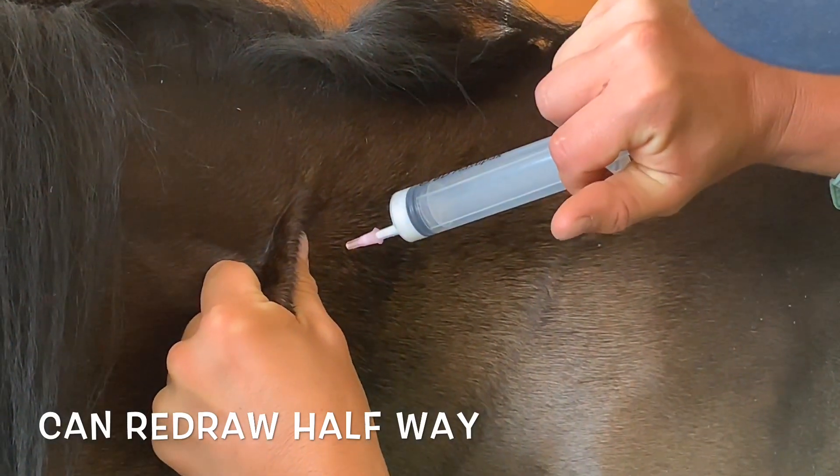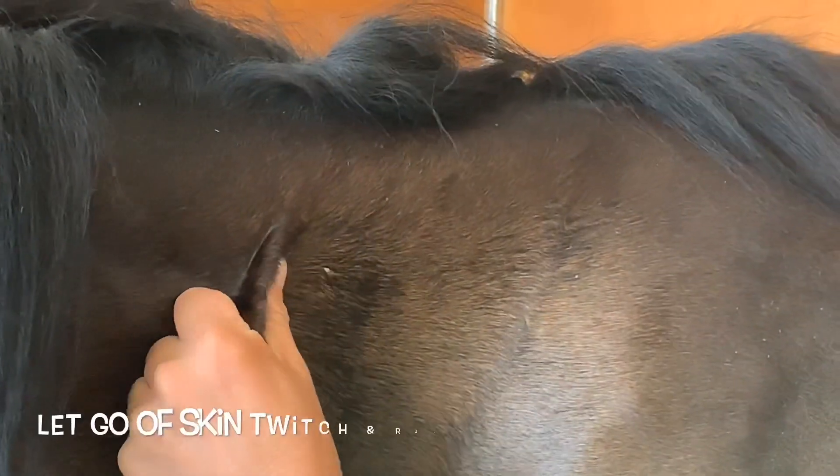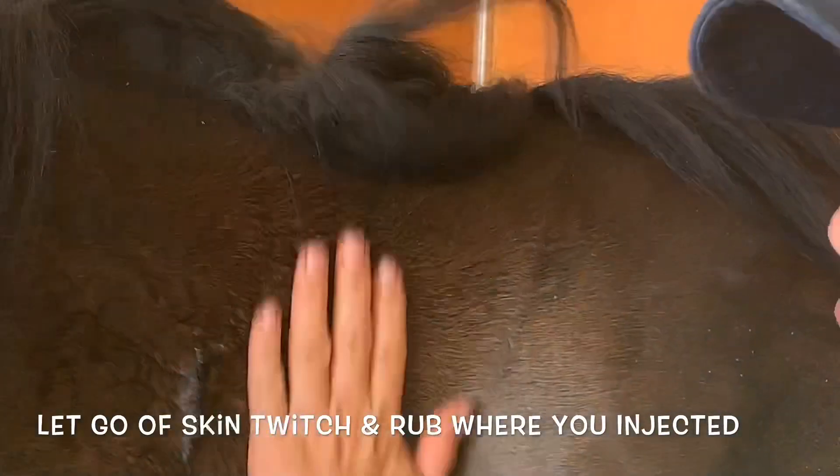I have still not let go of the skin twitch. I finish, I pull it out. Then I let go of the skin twitch and I give the horse a good rub.